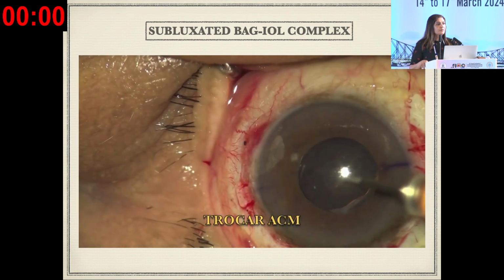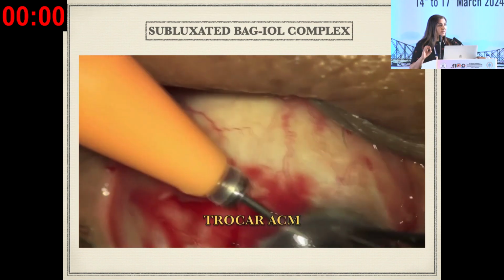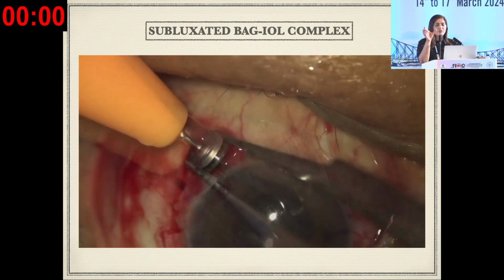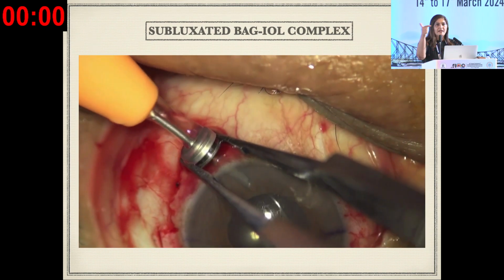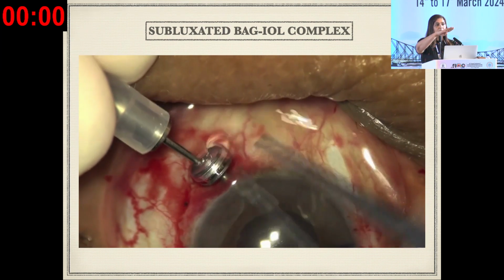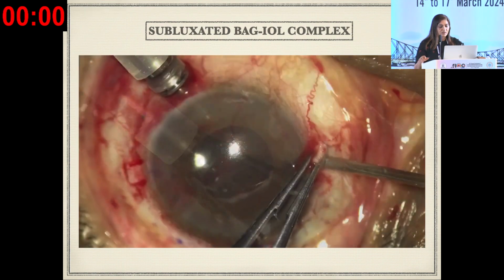You can go into the peer review and you can find out about these, how to place an L-shaped incision. It's actually a 6 millimeter incision, but they are L-shaped, so you just have a 3 and a 3 millimeter kind of a thing, and the remaining 3 millimeter is an internal lip, so it's like a valvular kind of a thing, works brilliantly.